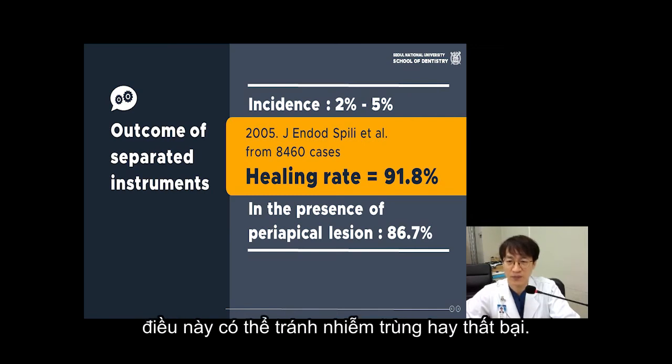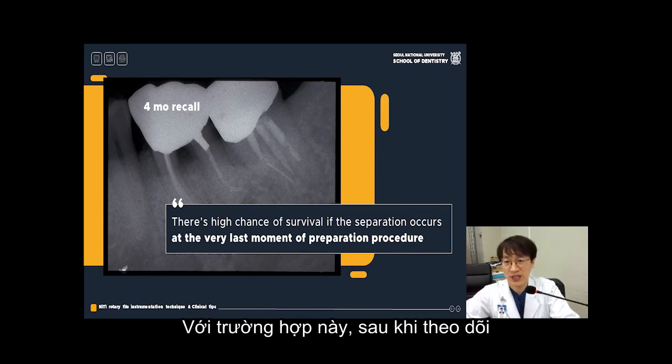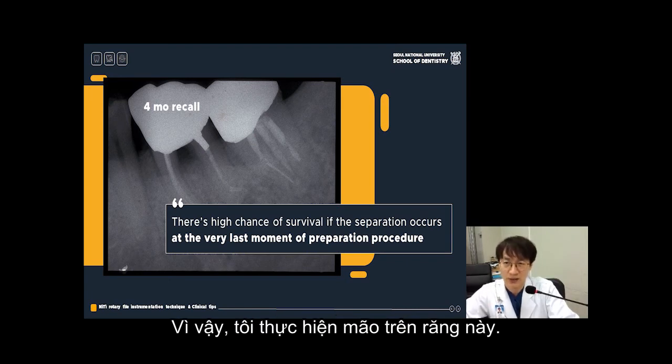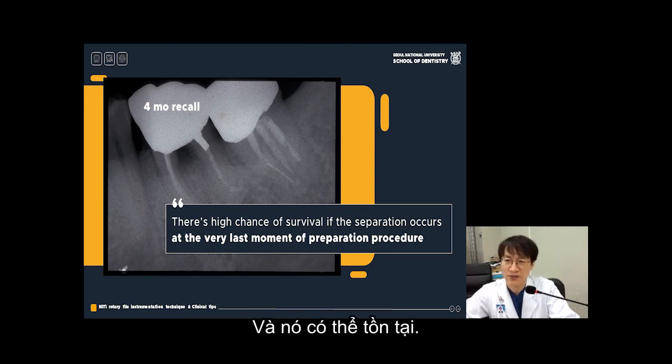That can avoid the infection or failure. So this case, after the follow-up, we have figured out that there is no problem with this tooth. So I did a crown on top of the tooth, and it can survive.